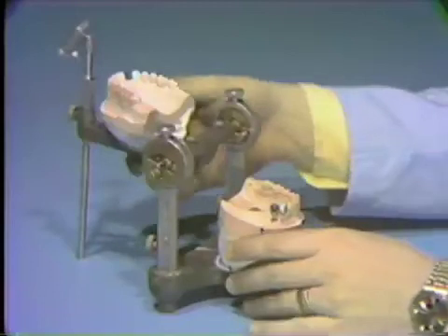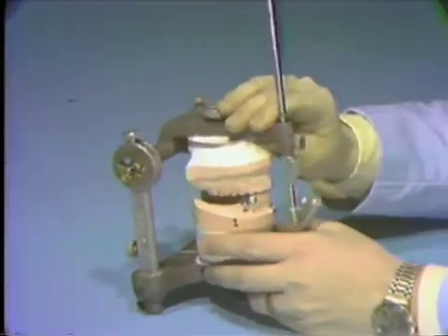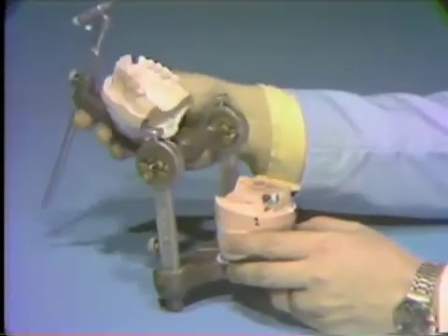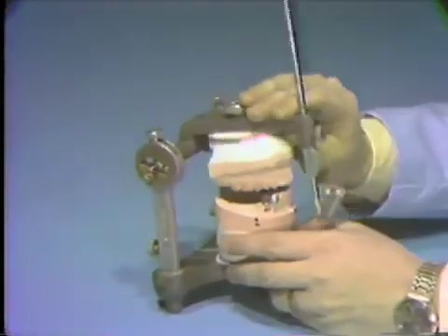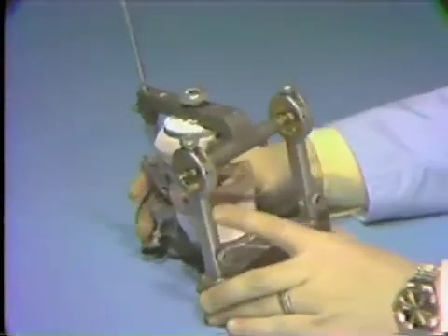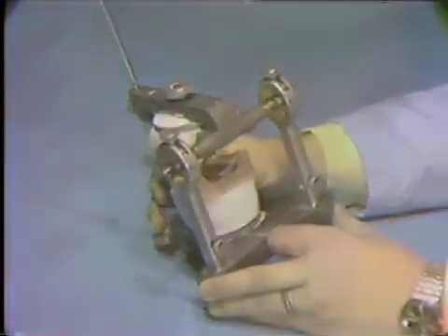After the wax pattern has been carved and surveyed, it should be returned to the articulator and the occlusion and occlusal harmony rechecked. Particular attention should be given to the occlusal rest area. If there is not enough room provided on the wax pattern for the metal occlusal rest of the partial denture without interfering with the opposing teeth, the rest preparation must be deepened.